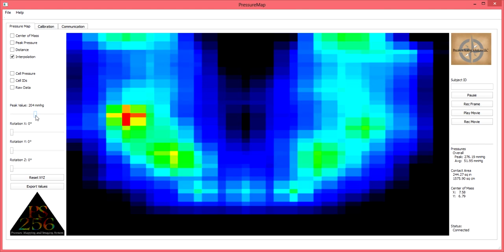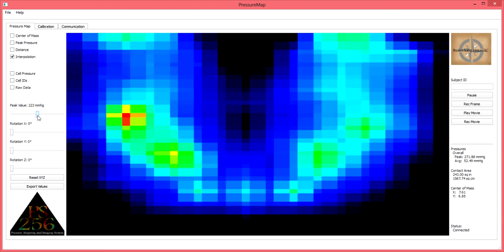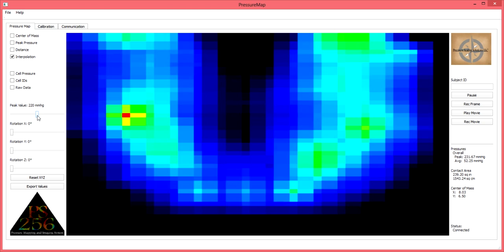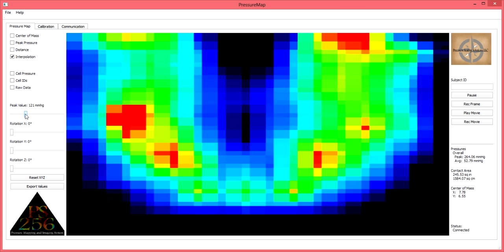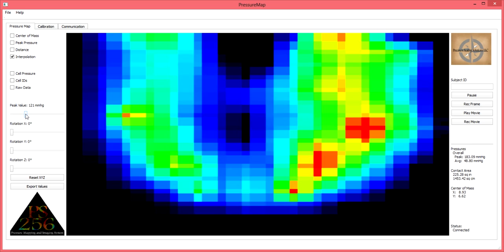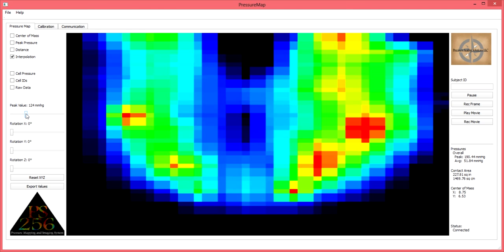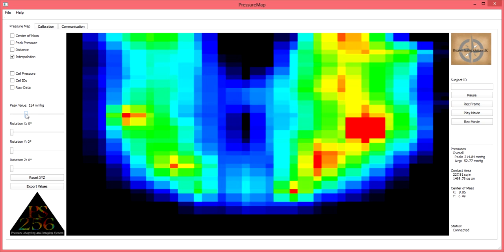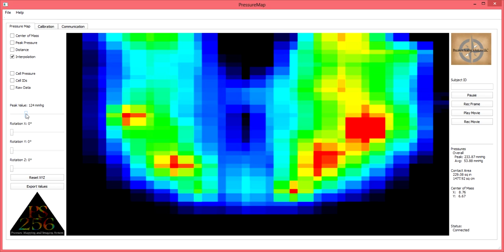This feature allows the user to identify where he or she would like the red graphic display to start. If the slider bar is set to 125, then any reading which is found to be over 125 mmHg will present in red. Be sure to refer to our clinical application tutorial for details on the benefits and applications of this feature.